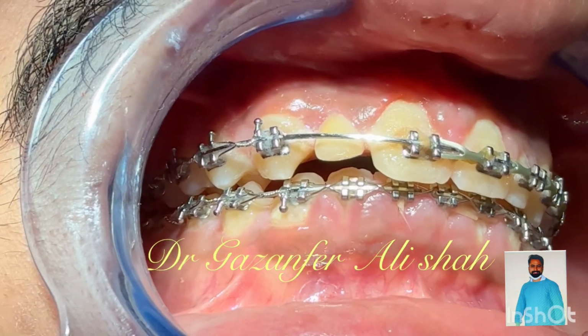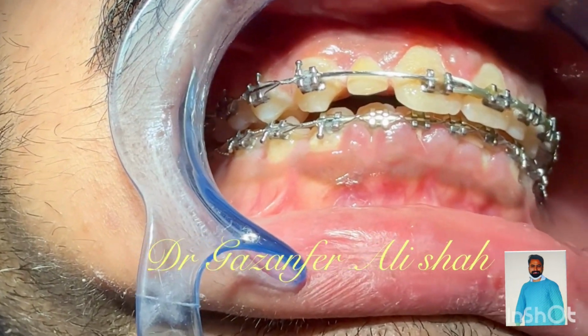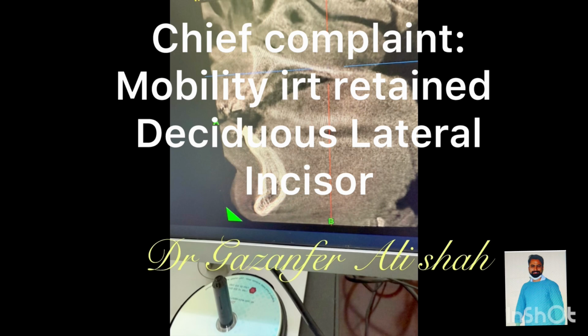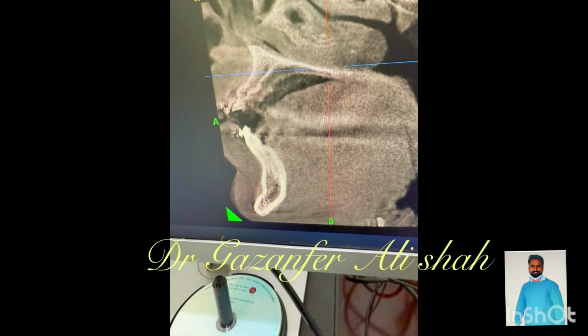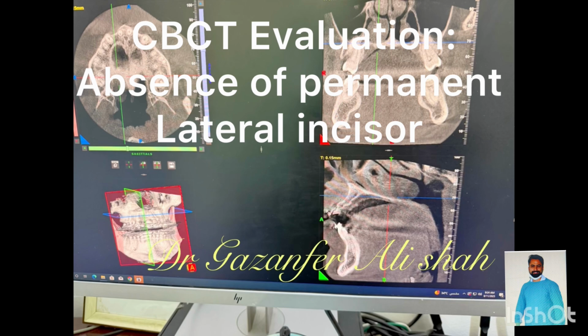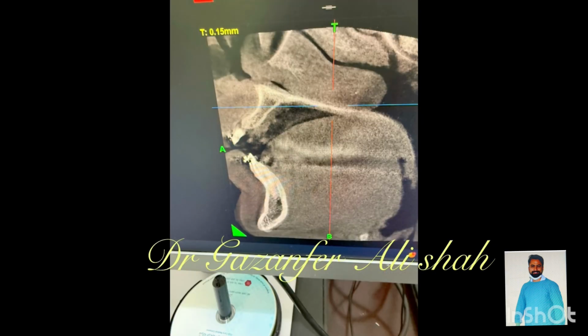Today I will be discussing with you surgical steps of dental implant placement. I'm Dr. Ghazan Ali, practicing registrar at KSA. This patient landed in our hospital with the chief complaint of retained deciduous tooth with missing lateral incisor. On CBCT evaluation, we found his proper ridge width with alveolar height for implant placement.